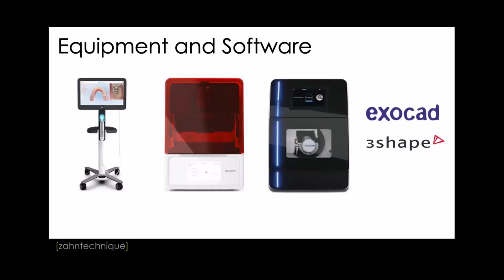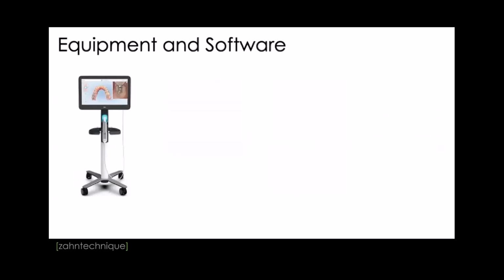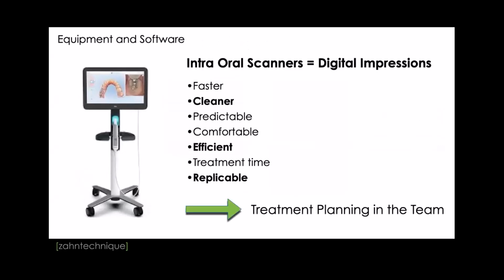That's very important to understand, how all these digital equipment and digital tools can work together to really have a very successful outcome. Especially when we look into intraoral scanners, an intraoral scan is equal to a digital impression, or actually is an impression, right? But what's the difference to the gooey silicone material, basically? So is it faster or cleaner, more predictable, more comfortable, more efficient treatment time, and especially is it replicable?